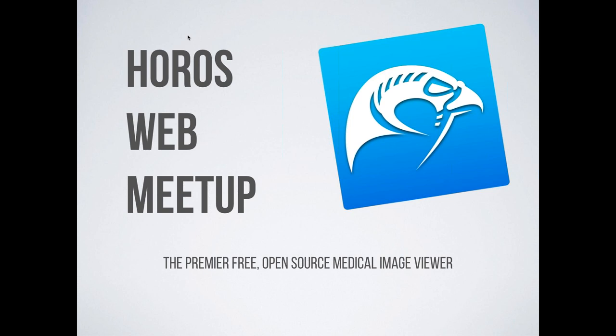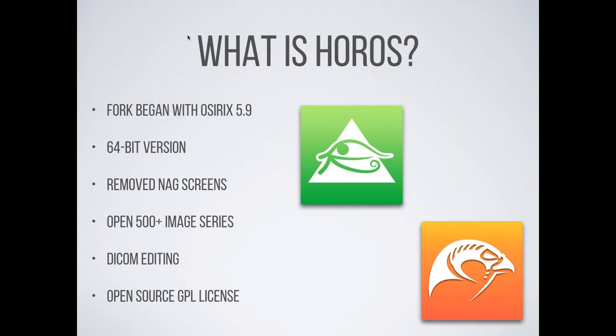Want to touch base on a number of different topics. Talk a little bit about the update we have scheduled for this coming Monday. Today's the 24th, that would make Monday the 27th. That update addresses some outstanding bugs that the community has made us aware of. And after the webinar, which will only last probably 10 or 15 minutes, we'll open up an opportunity for questions that you may or may not have regarding Horos. So without further ado, we'll go ahead and get started.